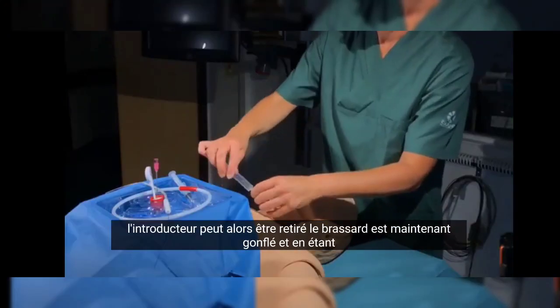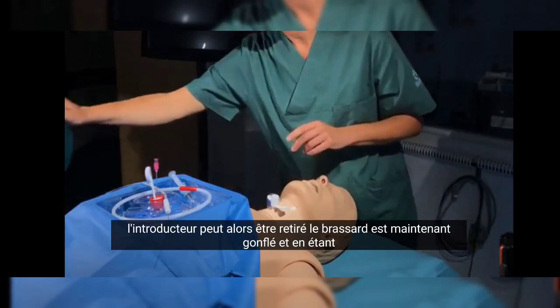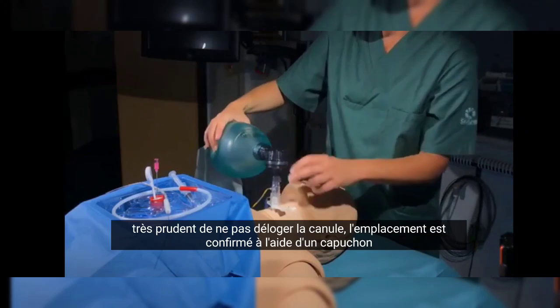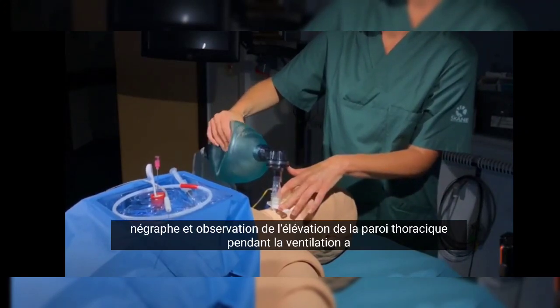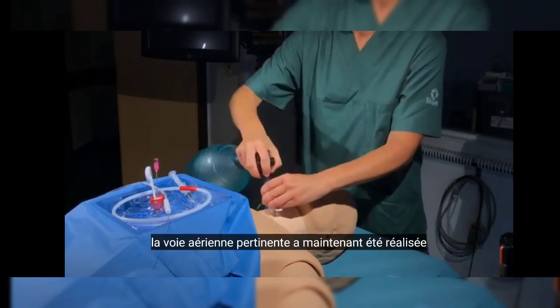The cuff is now inflated, and while being very careful not to dislodge the cannula, the location is confirmed by using a capnograph and observing the raising of the chest wall during ventilation. A patent airway has now been achieved.